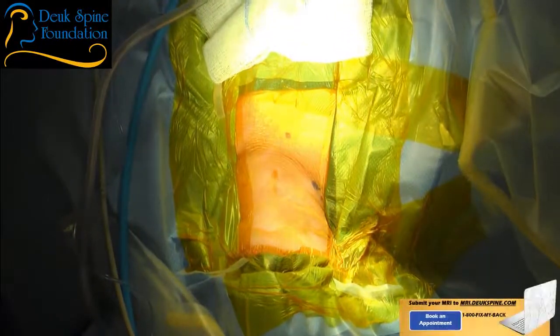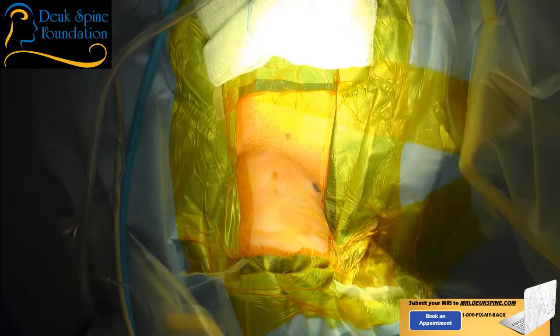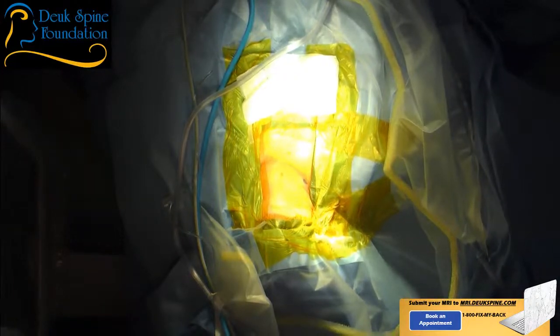So, for those of you joining us for the first time, the way we do these surgeries on the spine, and all spine surgery, you have to have a knowledge of exactly what disc you're operating on. You get that beforehand from the MRIs, X-rays, CAT scan, and then in the operating room, you use an X-ray machine usually to find the correct levels of discs. So that's what we're trying to do right now, but our X-ray machine needs to be calibrated properly, positioned properly, aligned properly, and the right amount of radiation, collimated in the right way so we can see the spine properly.